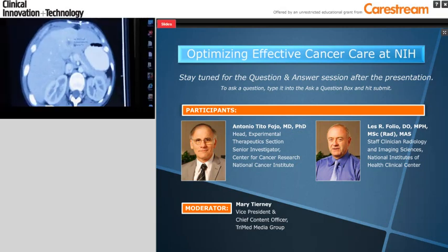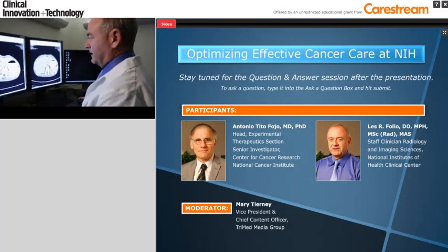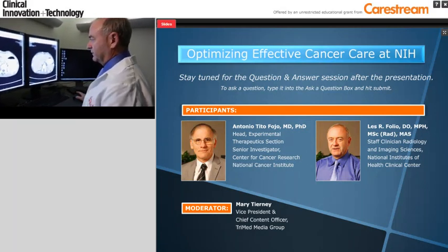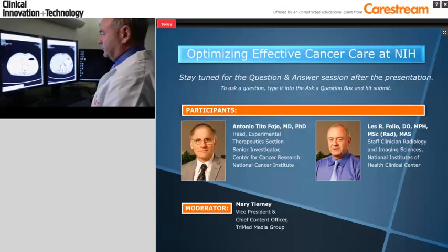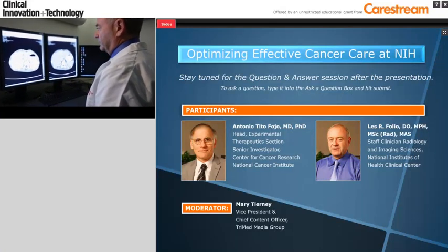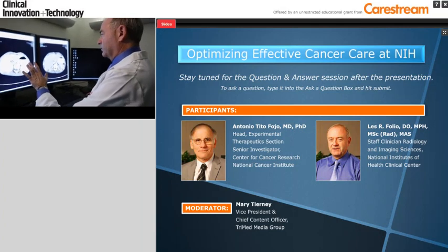You can see in the low density region, that's the lesion with an ill-defined margin surrounding that. So what radiologists do, standard of care these days, is to measure the lesion by coming across with the digital markers. What's different here, as you might have noted, is that the lesion management application has taken my linear measurement and also applied a volume to it, also found where the longest diameter was. I didn't pick the slice that actually had the longest diameter. It selected that for me.